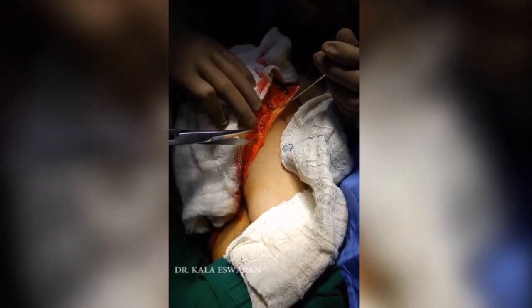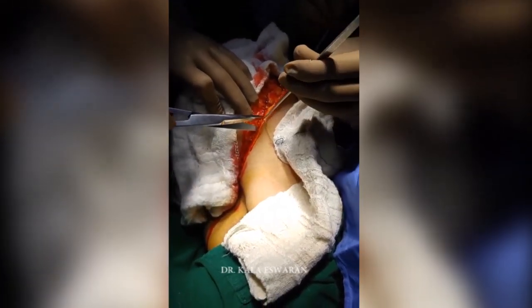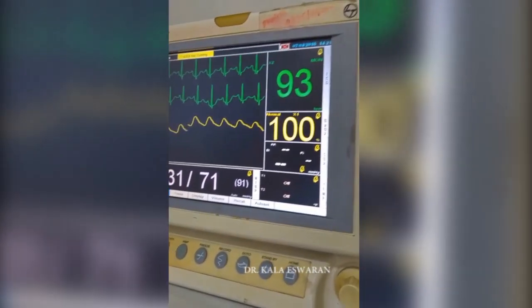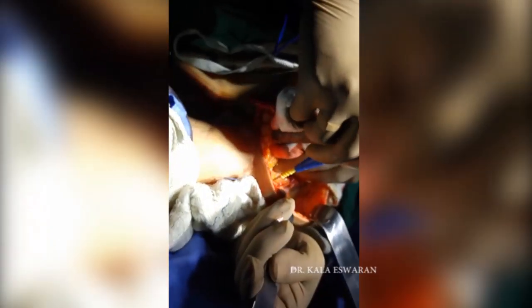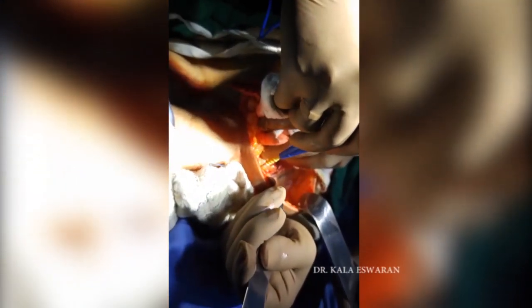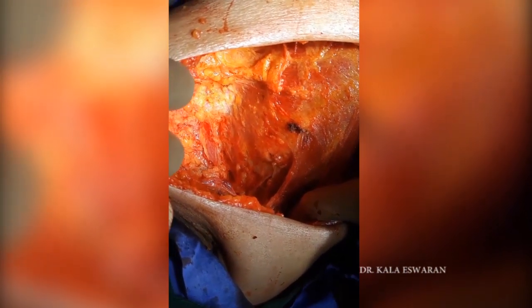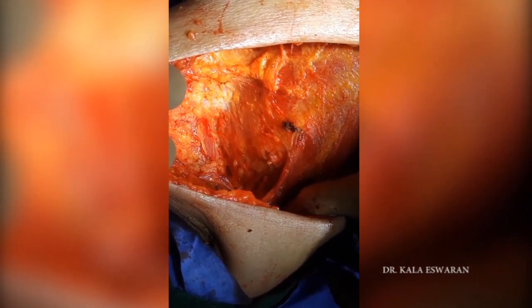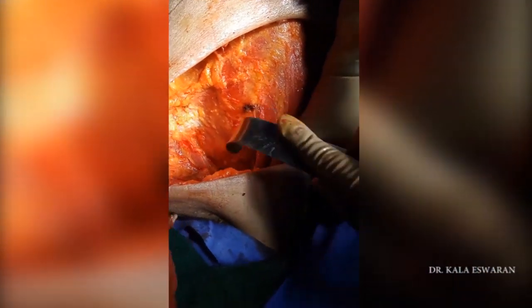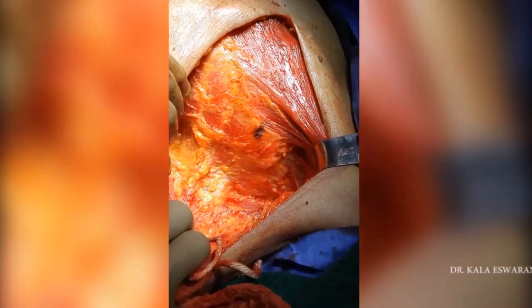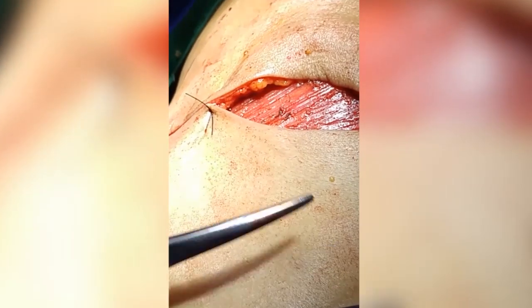The surgery has begun. You can see the parameters being maintained and the field is excellent, showing the bare muscles at the end of the surgery.